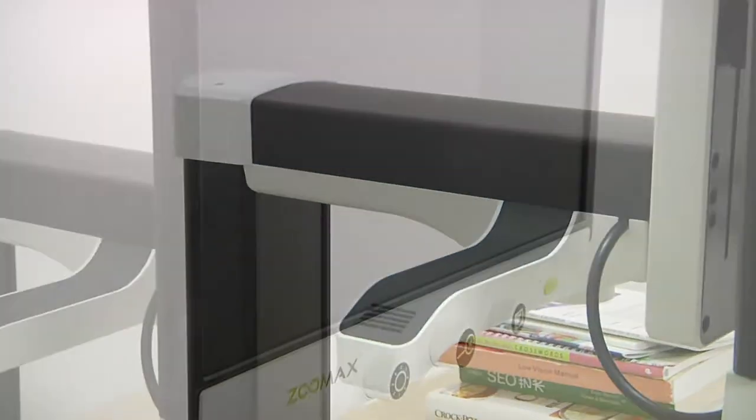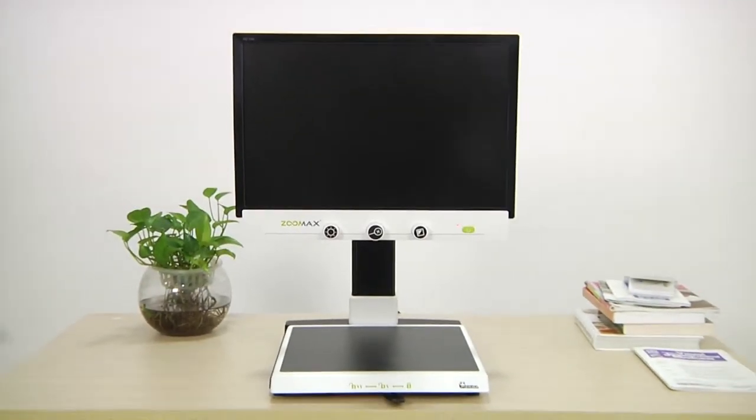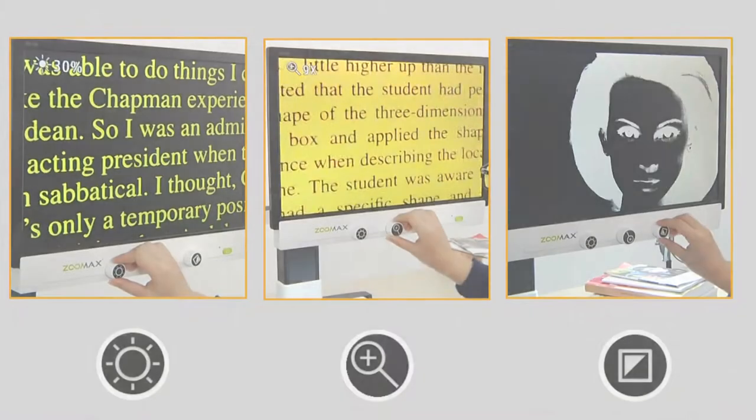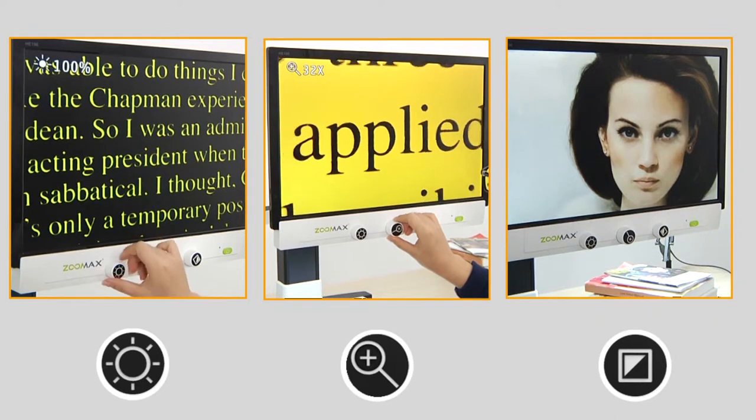The high contrast black and white appearance and buttons are fashionable and easy to identify. Three buttons with the most frequently used functions are easy to control for any new user from the beginning.